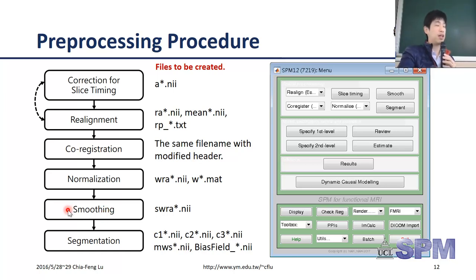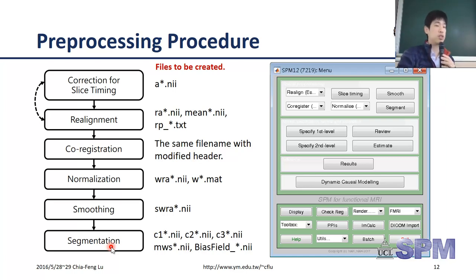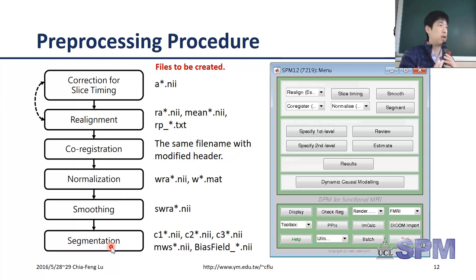The smoothing step is spatial smoothing - we make the imaging look a little more blurred, which helps reduce the noise contained in the image. Finally, we perform image segmentation, which classifies different tissue types within the brain. We focus on three things: gray matter, white matter, and CSF - cerebral spinal fluid.